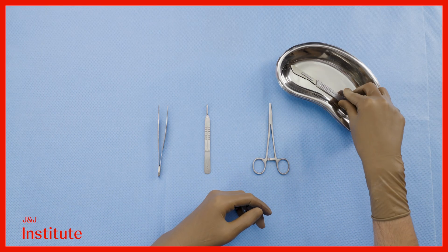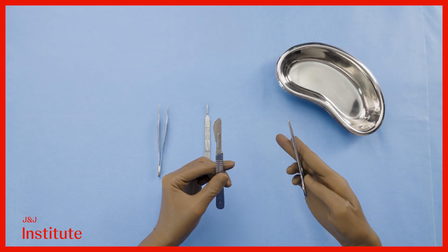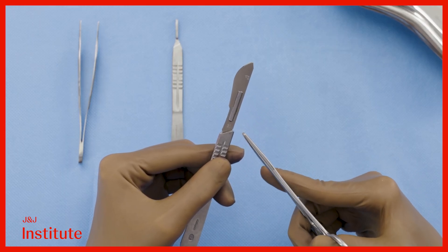Unloading a blade can be challenging and often poses a risk of injury either to yourself or another member of the operating team. Hold the scalpel in your left hand and take a needle driver in your right. Instead of holding the blade near the tip as we did before, hold it proximally near the base.